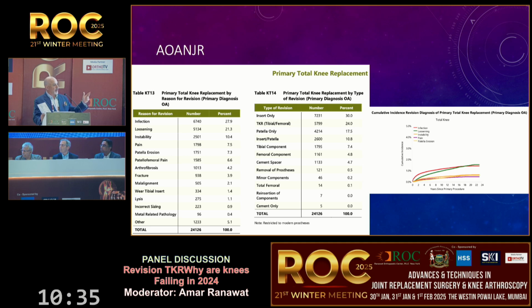Who puts antibiotics in their cement? Oh, we had 3 out of the group, okay, that's good. Who uses pre-mixed antibiotic cement, like Simplex? All right, fine. It's very expensive to use that kind of cement. I'll add it myself, but I think it's an issue, right? If you need to add antibiotics, it can affect your cement. How much antibiotic you add, all these issues are part of the cement technique process.